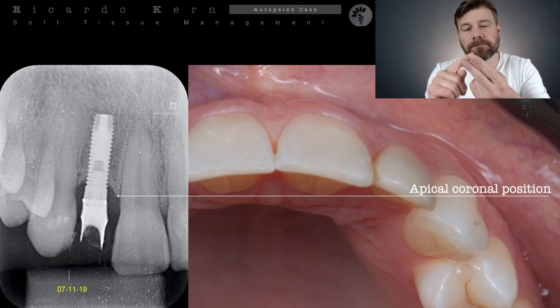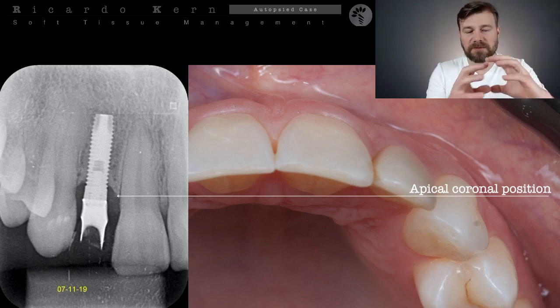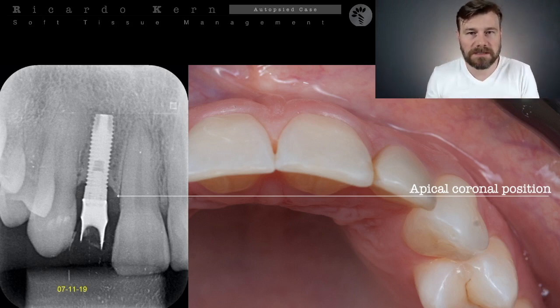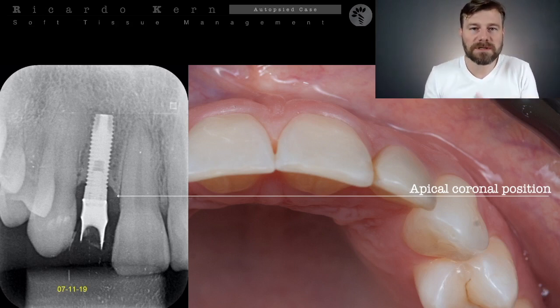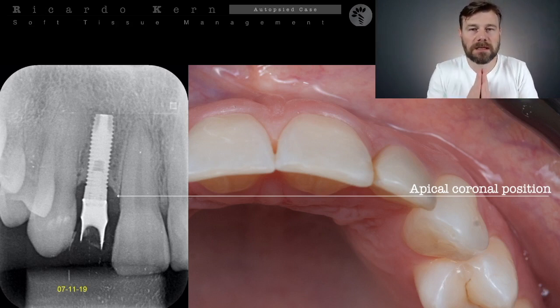A case with recession and loss of the papilla usually is going to require that we sink the implant: we take the crown, take the abutment, use a cover screw for this implant, and we let the soft tissue come back on top of this implant naturally, or sometimes move a flap over this implant, but we need to let the tissue be back there, to graft in this position, and just after some time to reopen this implant.